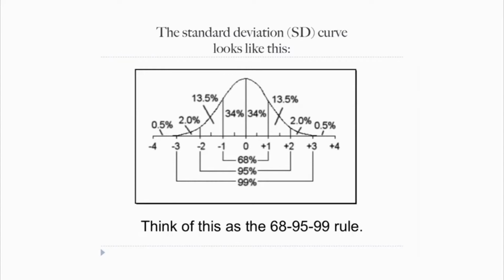When you get out to 3 standard deviations, if they tell you, oh, your T-score is -3, then you know there's very few people in this category. Only 2% of the population would have a standard deviation that's -3. Now remember, if it's a T-score, that means you're talking about young people, comparing you to young people. Later we'll look at what it means for Z-score.